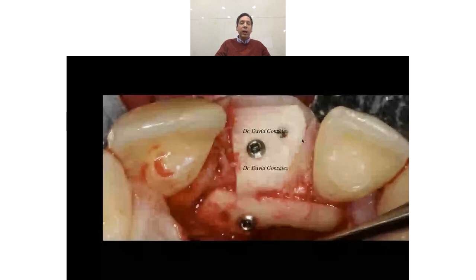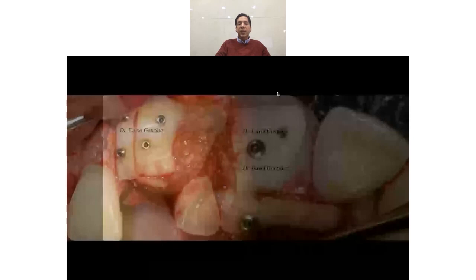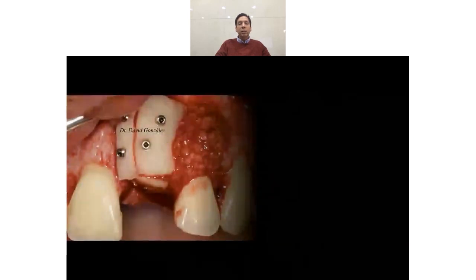That's why, using a rongeur, I shaped this small triangle in here, trying until, by friction, I could fix this triangle. And you can see here the buccal bone level, the level of the buccal block. So it will act as a tent pole when I put this particulated bone over the root.